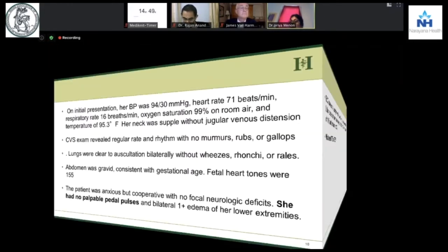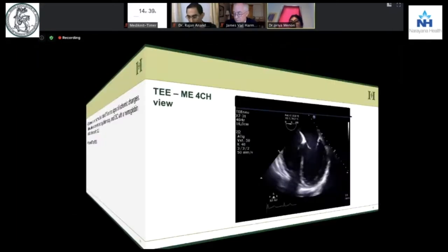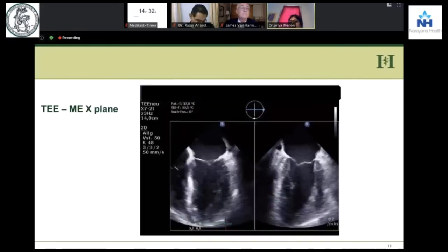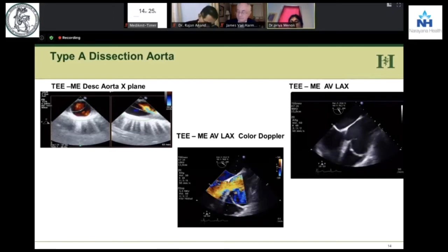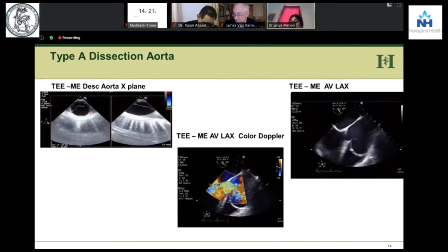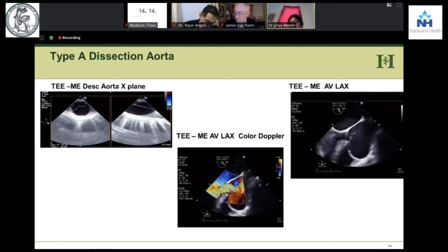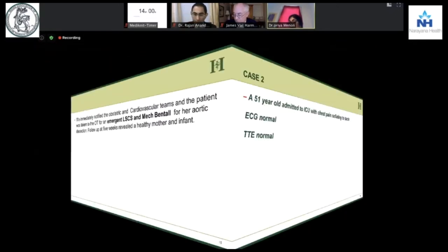Should we do a transthoracic or transesophageal echo? We decided to do a transesophageal echo. The four-chamber view looks okay. We do all the views of the aorta, and very surprisingly, there is an AR — but we could not hear any murmur. So this was our diagnosis. We called up the obstetricians and the cardiovascular team. The patient was shifted to the OR, a LSCS was done with a mechanical Bentall procedure. We followed up the patient — both the baby and the mother were doing fine. This was all possible because of a TEE.